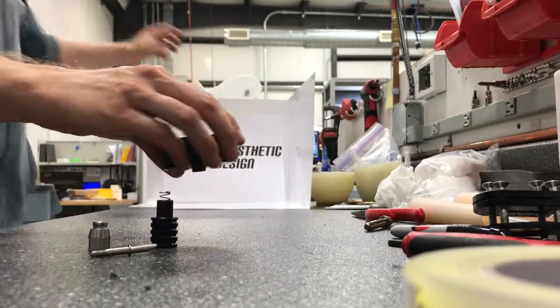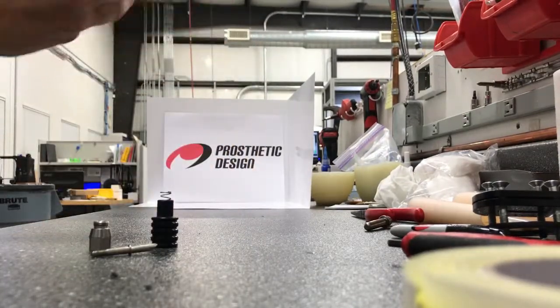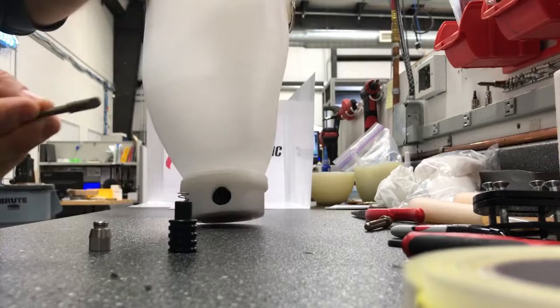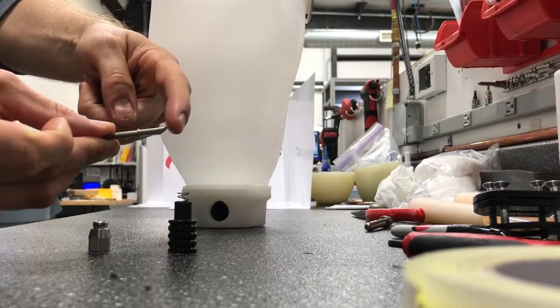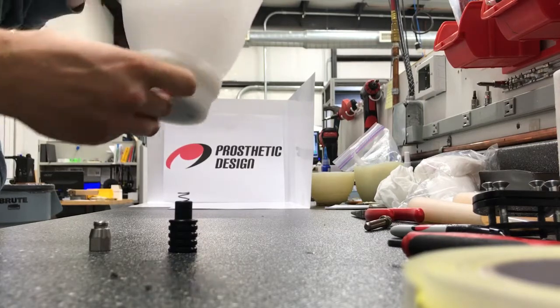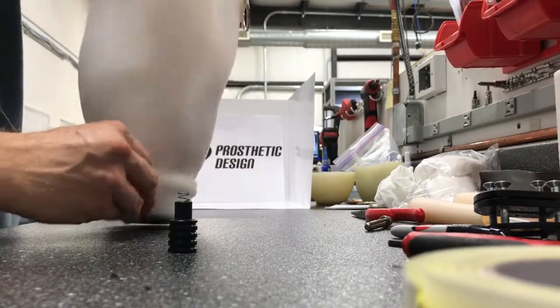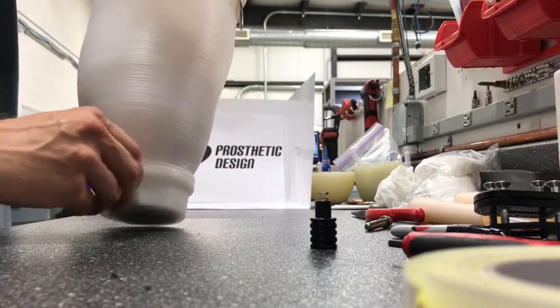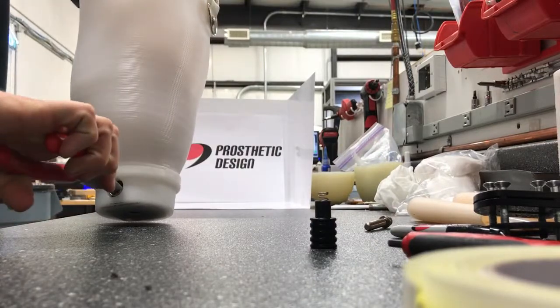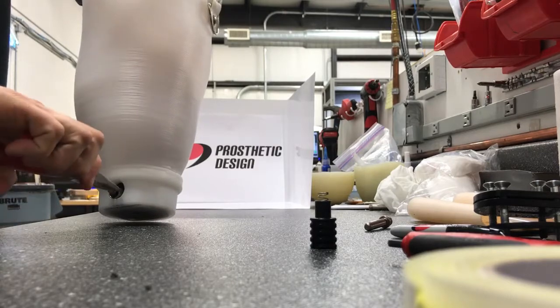So we have our socket. The hole's open in the side hole. Again, this part right here, we will put that in so it's towards the top. We will then add in our housing. We'll be able to reel it in so far. I like to take my needle nose and do it the rest of the way.